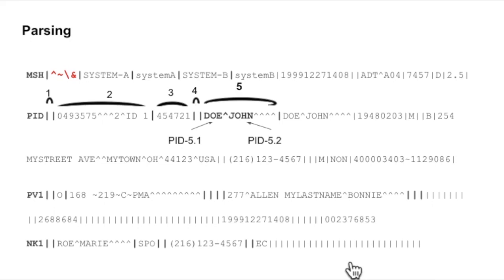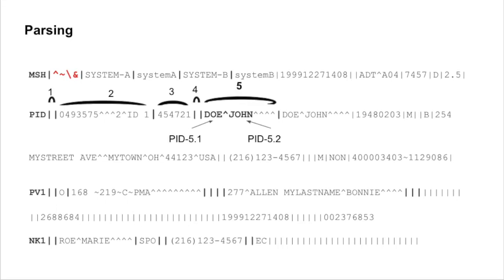One important thing to mention is that for all segments of the HL7 message, the counting starts from the second field, except the message header - the counting starts from the first field.